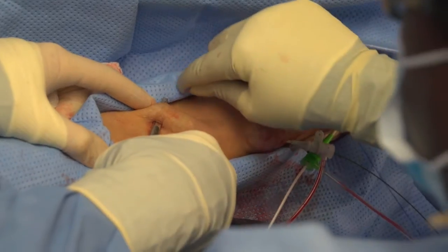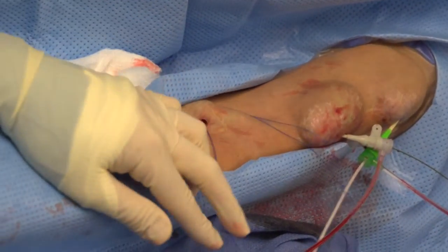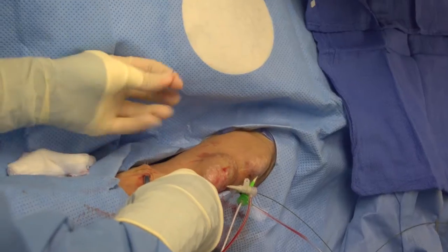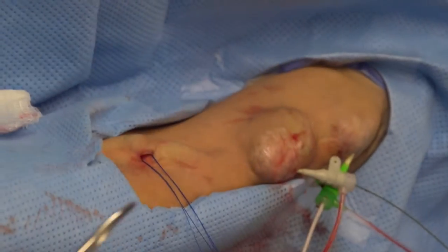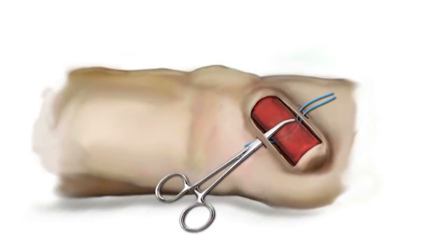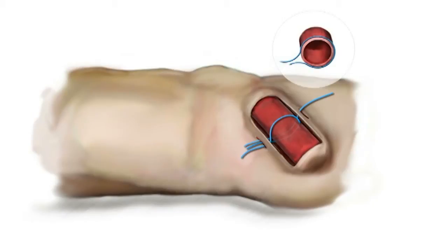Once we have the second pocket, we tunnel all the way underneath. As shown in the diagram, we tunnel underneath the fistula, make the second incision, and pop through with the Kelly clamp. In real life you can see us grab a 2-0 Prolene suture and pull it underneath the access. We then make our dissection across the top of the access, grab the suture, and pull it through — the Kelly clamp comes across the top of the access and pulls the suture through.